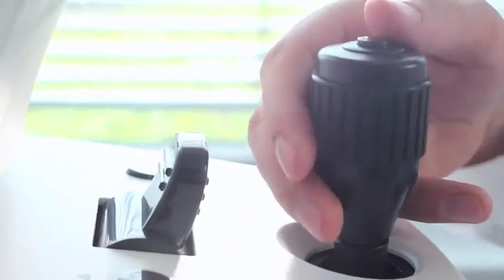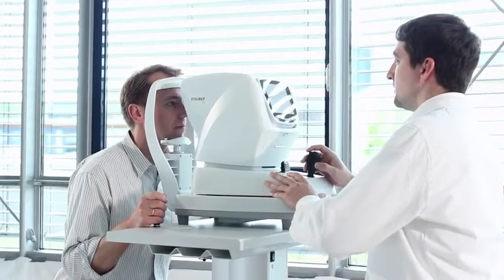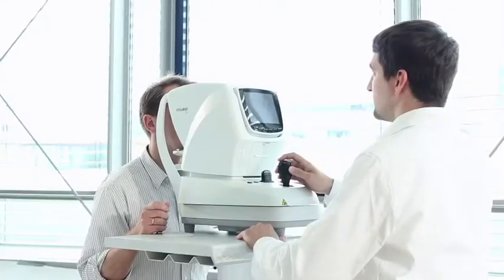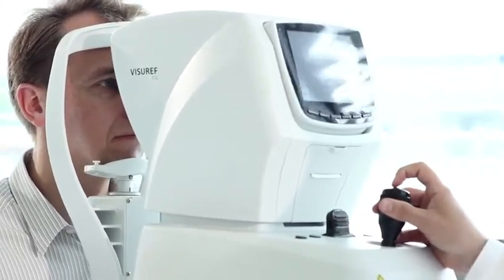You can perform refraction, keratometry, or both at once according to your preference. Once the measurement is complete, move over to the other eye and repeat the process. The Zeiss Viseref 100 automatically detects laterality.